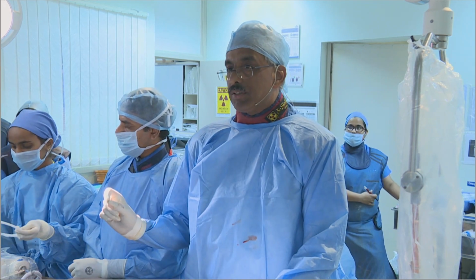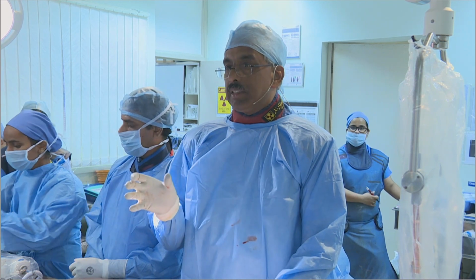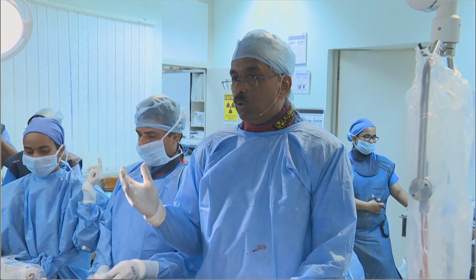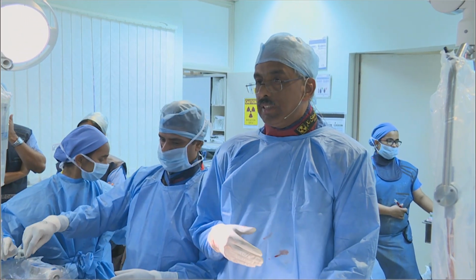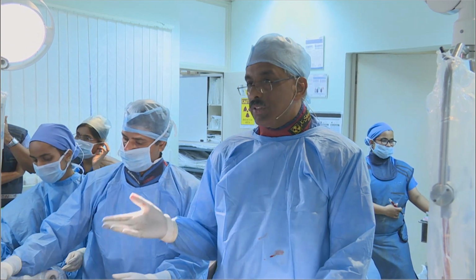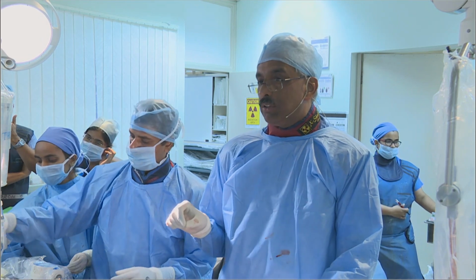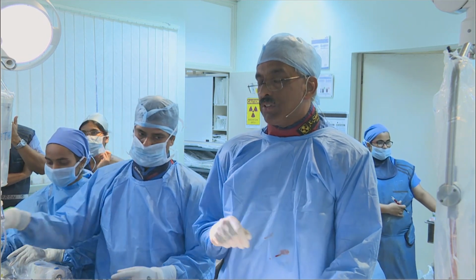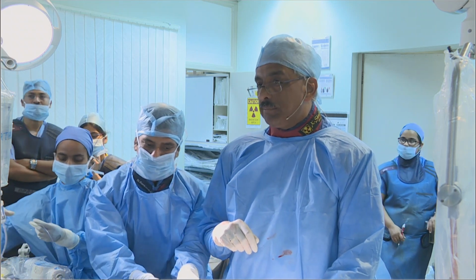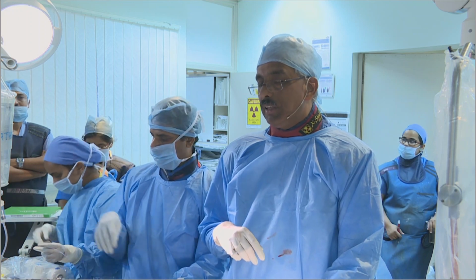One is the diameters: distal, at the junction, and proximal, which we clearly saw was 3.5/4, and also the calcium extent. Without this, you could possibly have rotablated, but the distal PDA is difficult to get to, and that was tight too. The bifurcation was tight. Getting a rotablator right down there would be a little tight. Maybe the proximal part would be rotablated. So I think IVUS would be mandatory.